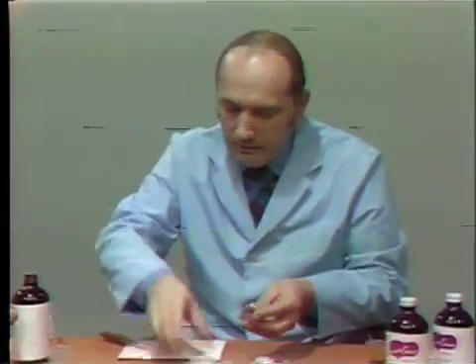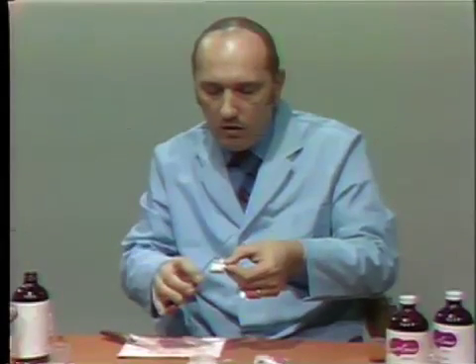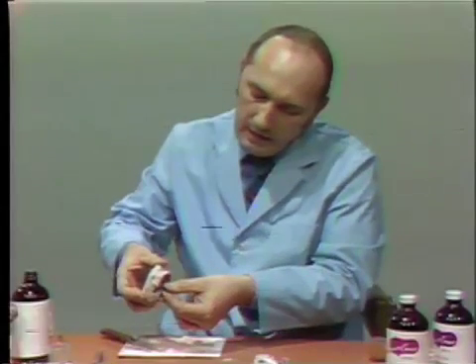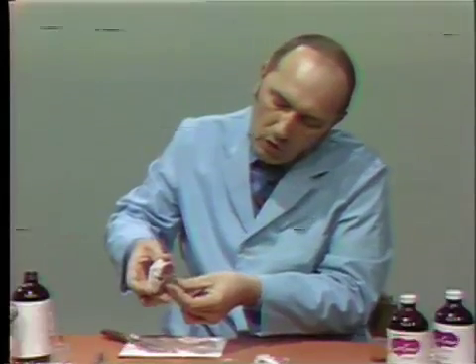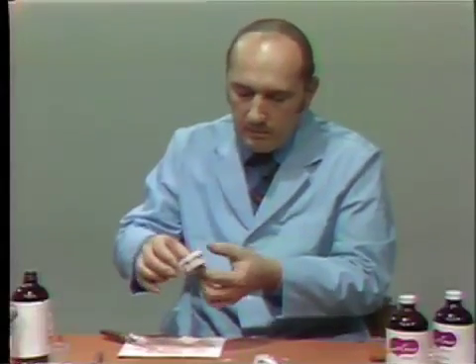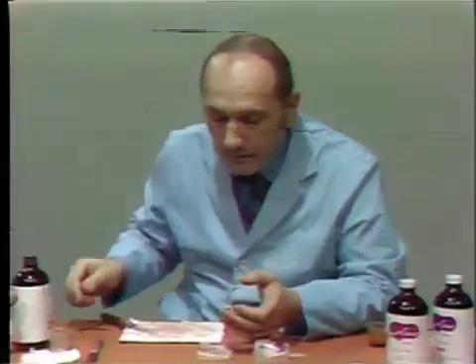On a maxillary model, it's just a little bit different. Take the impression cement and apply it mostly to the lingual of the impression tray. Then place it in and seat it so that the material will all run forward. When it starts coming out the anterior part of the tray, get your hands out and let it come to rest. When the material has hardened sufficiently, it can be pulled out and examined to make sure you have the proper detail. If you do have the proper detail, then a model is made, poured up in stone.